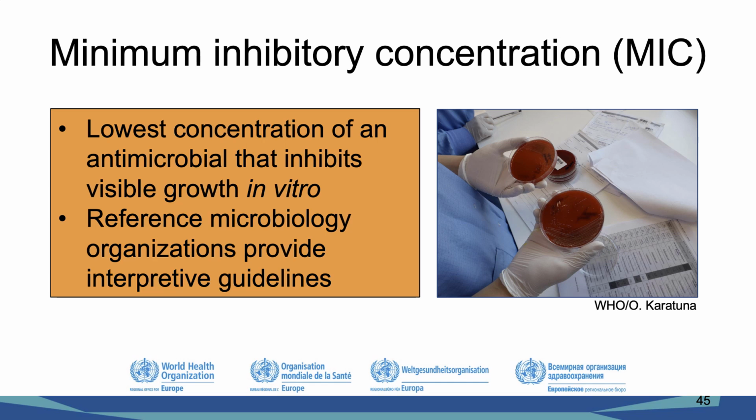As we've discussed in previous modules, the minimal inhibitory concentration, or MIC, is defined as the lowest drug concentration that prevents in vitro growth of a bacterial isolate in culture. Laboratory governing bodies like the Clinical and Laboratory Standards Institute, or CLSI, in the U.S., and the European Committee on Antimicrobial Susceptibility Testing, or EUCAST, publish clinical breakpoints that are used to interpret MIC values generated by frontline clinical laboratories. An isolate with an MIC value above the clinical breakpoint would be interpreted as resistant, while an isolate with an MIC below a clinical breakpoint would be considered susceptible to a particular drug. For some drugs, CLSI may recommend interpreting some MICs as intermediate or susceptible dose-dependent, while EUCAST may recommend a slightly different interpretation, such as susceptible increased exposure.